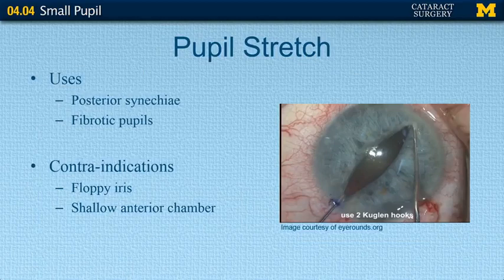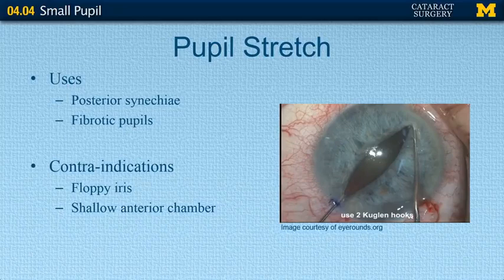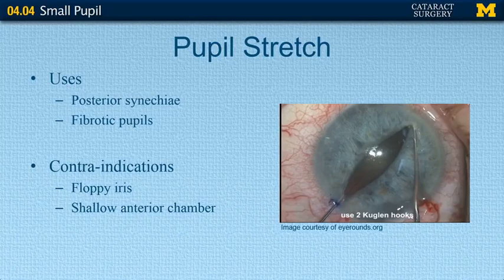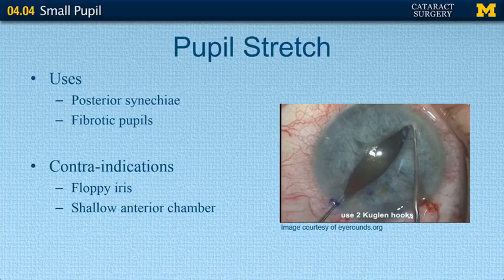Pupil stretch is typically used in cases of posterior synechiae or fibrotic pupils. Keep in mind that if you do pupil stretch in fibrotic pupils, it's not unusual to see some bleeding due to the scar tissue on the pupillary sphincter. However, you don't want to use pupil stretch in cases of floppy iris because it will make the floppy iris more pronounced and complicate surgery. Also avoid it in a shallow anterior chamber, as instruments may hit the cornea and cause endothelial dysfunction.